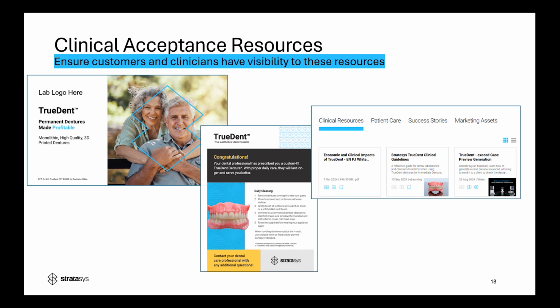What we'd like to encourage you to do, as we know all digital dentures are very susceptible to different types of cleansers, some of which are very abrasive and break down materials, is to provide them this care card, as with any printed or milled denture, to help them understand how to take good care of their dentures.